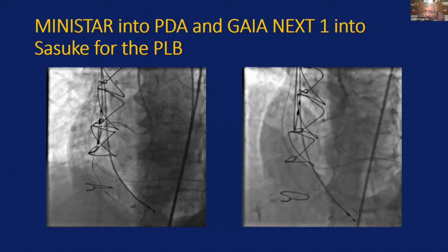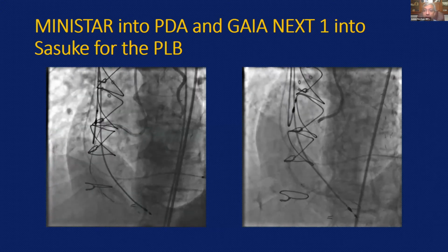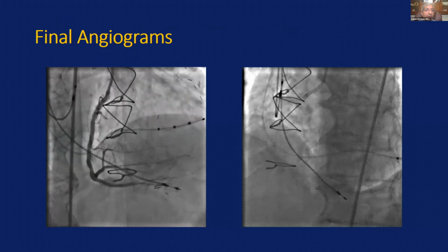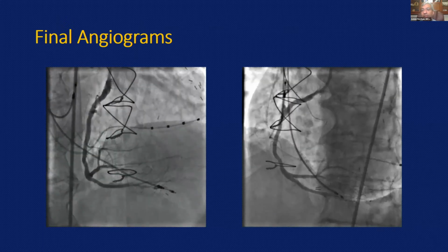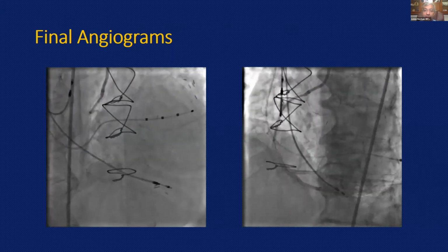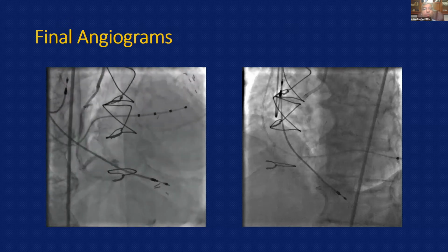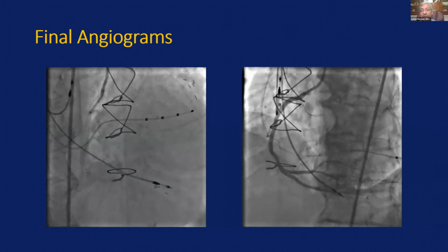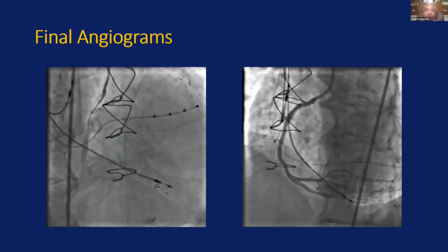And again, with the dual lumen catheter, I got pretty amazing tip control and was able to wire this posterolateral branch and actually do a bifurcation stenting strategy and take care of both the PD and the PL, and ultimately got an outcome that I thought was acceptable and surprisingly good, given the fact that there was no previous visualization of this PL at all. And I think in turn, this probably made a big difference in terms of outcome for this patient, in terms of longevity.